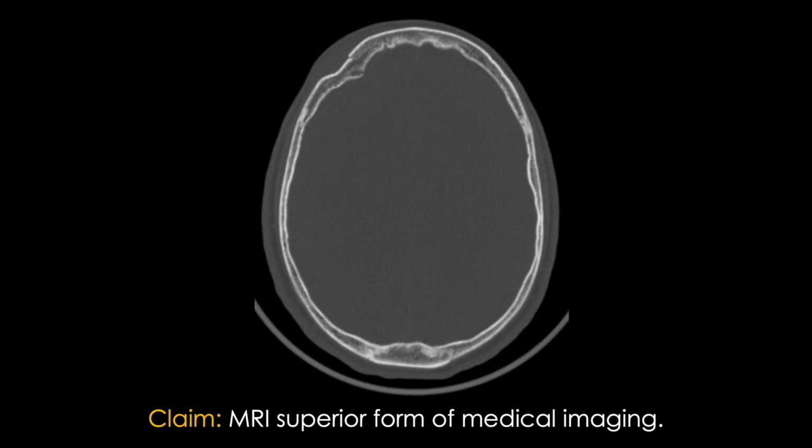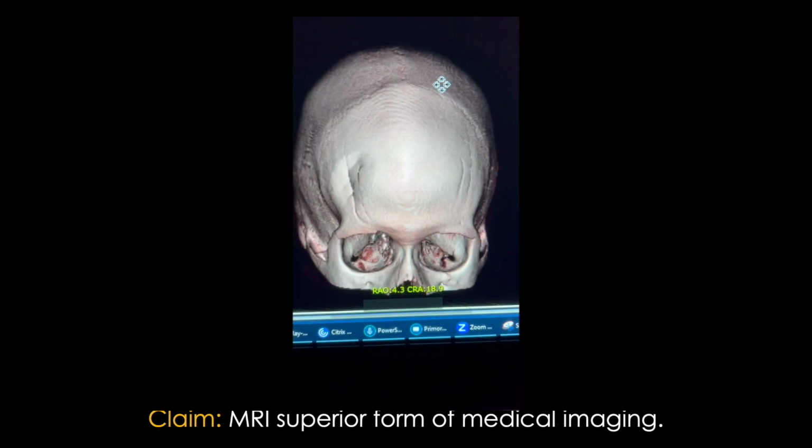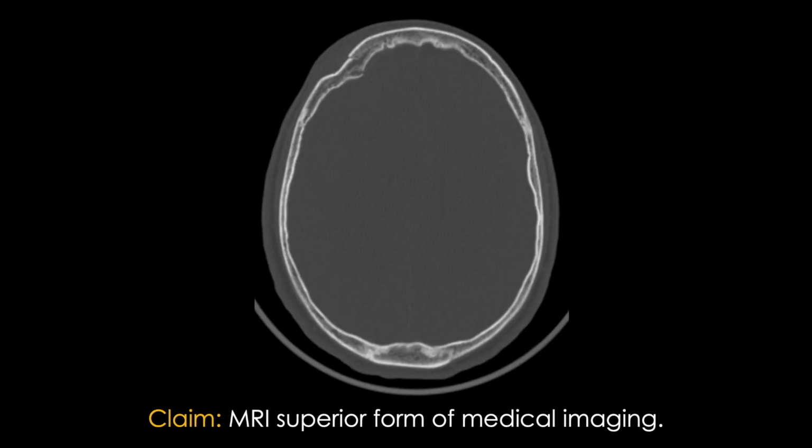What about fractures? Look at this picture. It's from the same CT scan, just processed in a different way, and appreciate how you can see these very fine fracture lines associated with this deformity along the right frontal bone. The video mentioned 1 millimeter resolution of MRI. Well, these CT images are 0.5 millimeter thick. 0.5 millimeter. And unlike MRI, if we want a different slice thickness, we can just reprocess the raw data into the thickness we want. We can even create these fancy 3D models of the skull from that same CT scan within seconds.